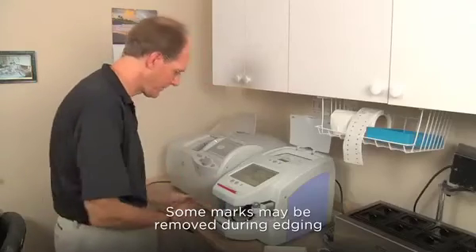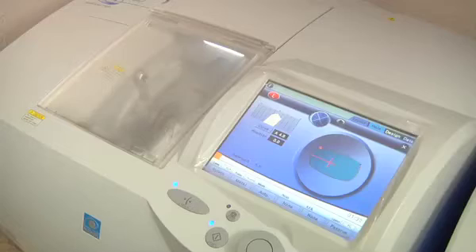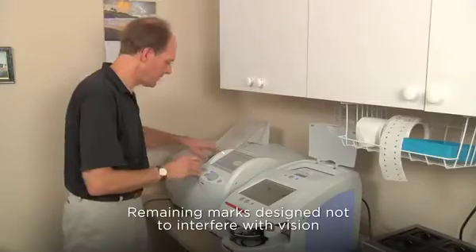It is expected that some of the markings will be removed during the edging process. The Transitions Vantage lens alignment markings are permanent and will likely remain, but will not interfere with the wearer's vision.